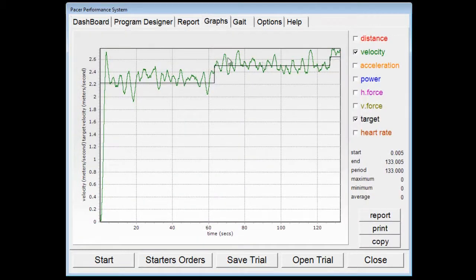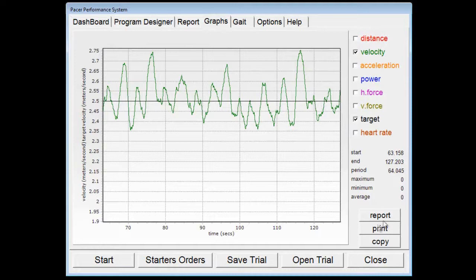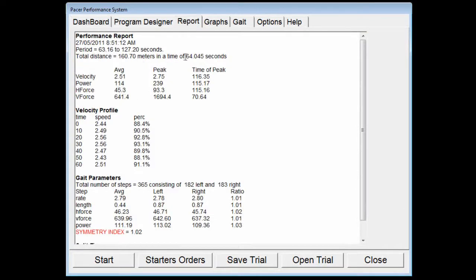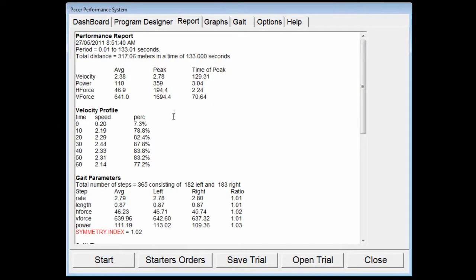If we go back to the graphs and want to look at one particular portion — say the second stage — we can zoom into that portion of the graph. If we hit report again and go back to the report, it will now only analyse that period of the trial. As you can see, in that period they covered 160.7 metres in a time of 64.045 seconds, and the average velocity and peak velocity for that period are shown. We can zoom back out and run the report again to get results over the whole trial.